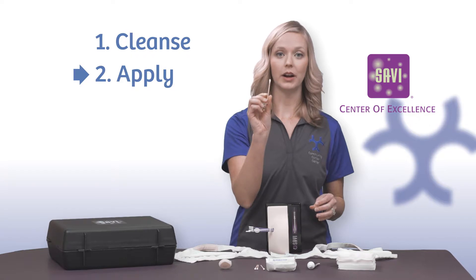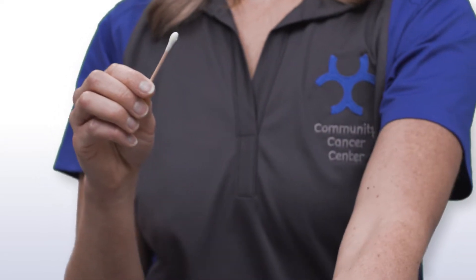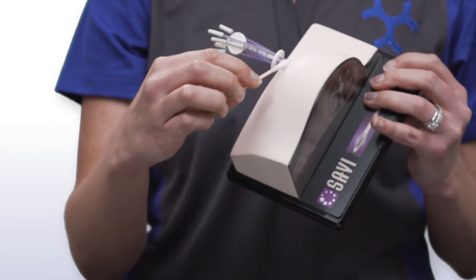Apply. Take one of the q-tips and a small amount of ointment and apply to the areas surrounding the site. This will help your site heal.